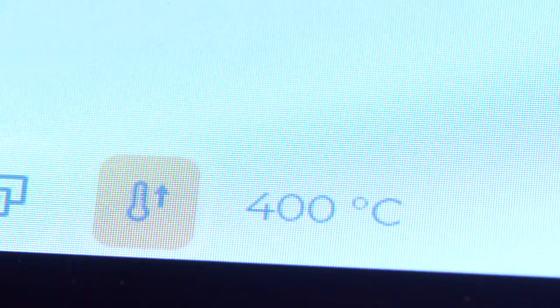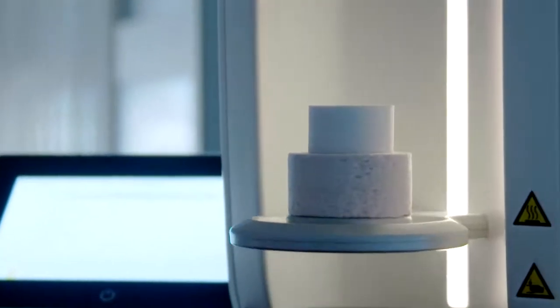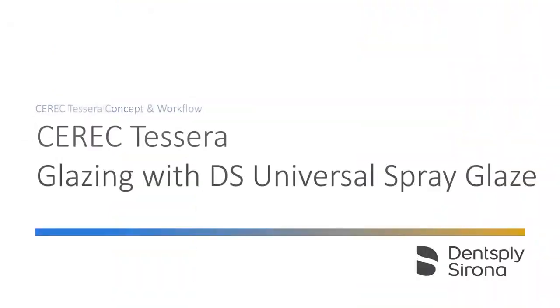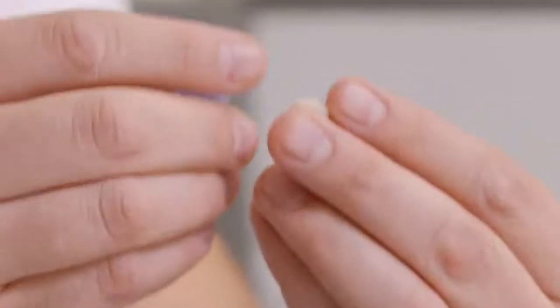To shorten the subsequent firing time, the Cerec Speedfire furnace is preheated to a starting temperature of 400 degrees Celsius in the preheat program. For the fastest and most effective results, we recommend the use of Dentsply Sirona Universal Spray Glaze.